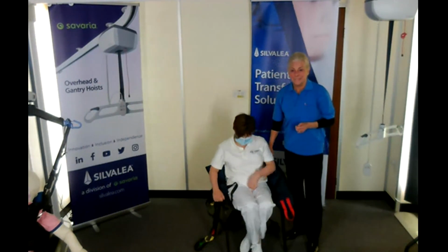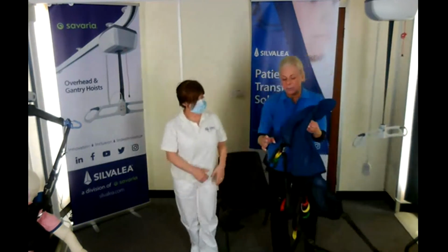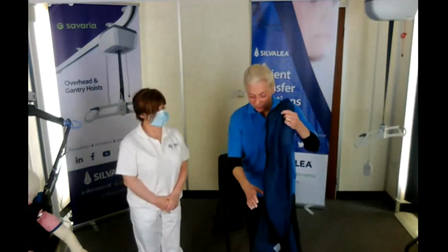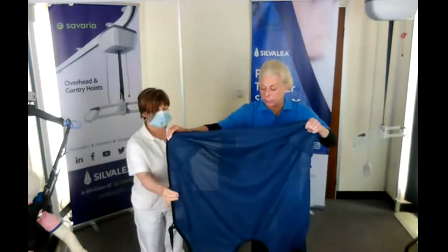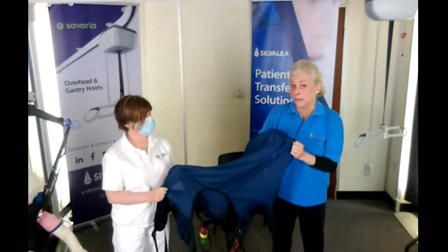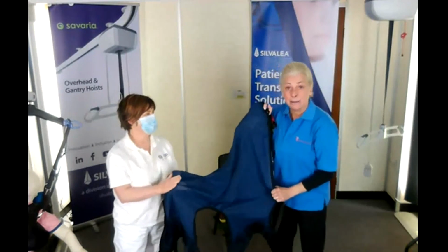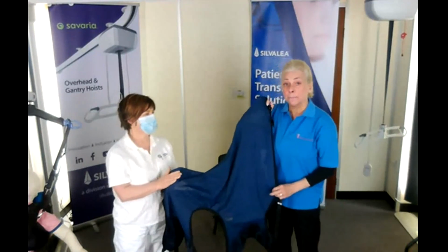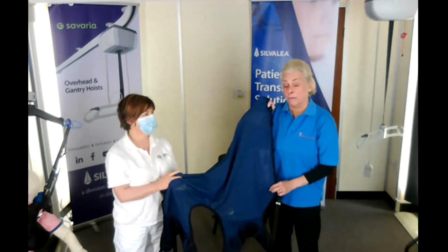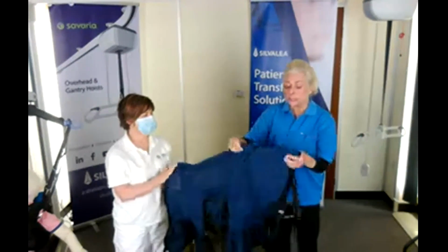No, it's okay. So this fabric is, because it's lightweight, often children will have very fitted seating. So it's the lightest one that we can supply. And it is very fine, as I said, so that's why it is so popular. The single layer has a weight limit of 10 stone, which is 64 kilograms. If you've got someone of a higher weight, then we would offer a double layer. So it'd be 2 layers.